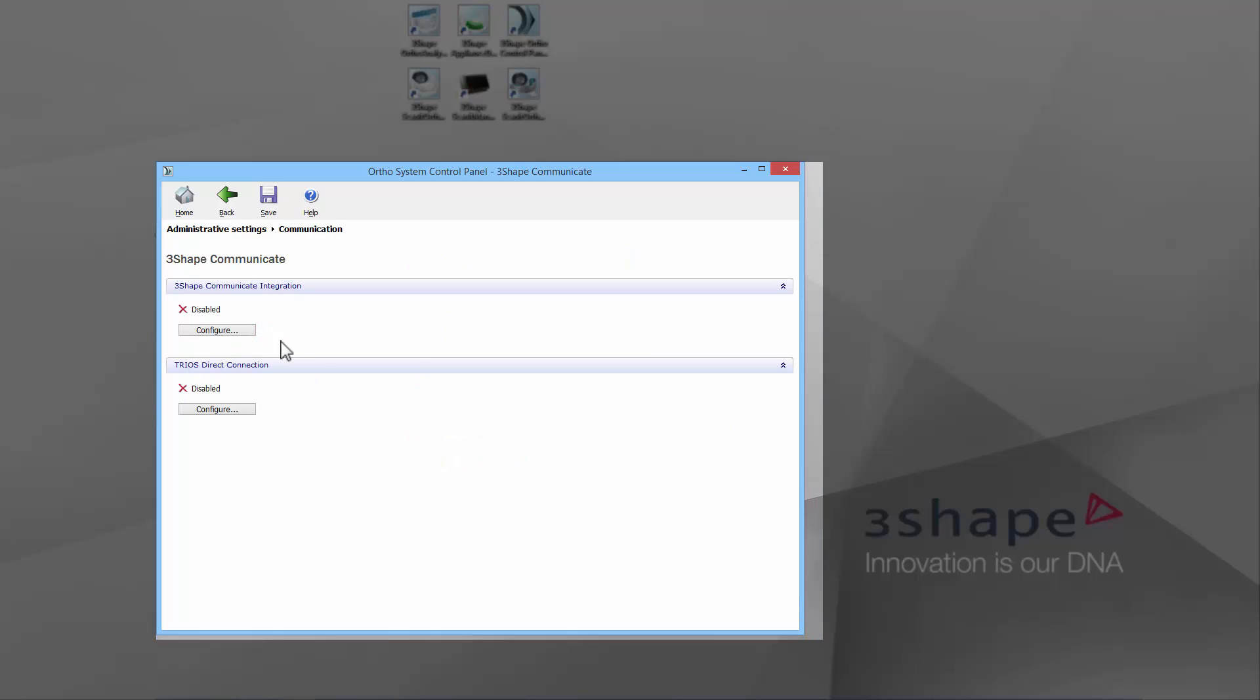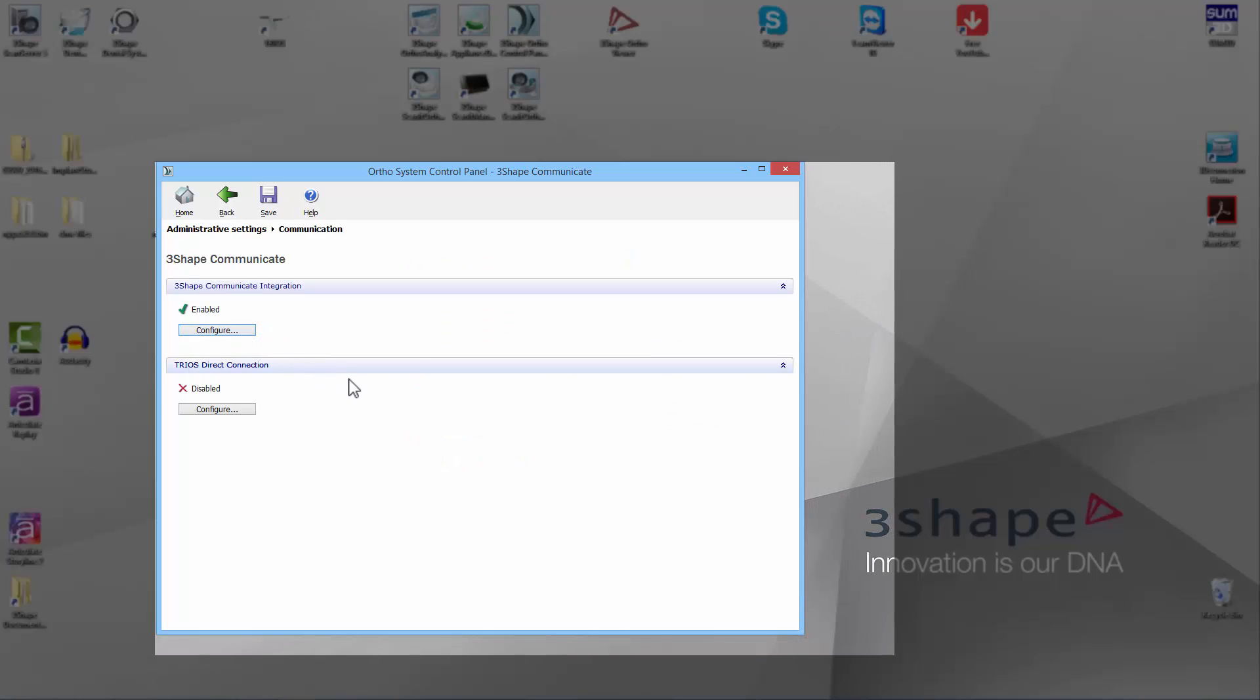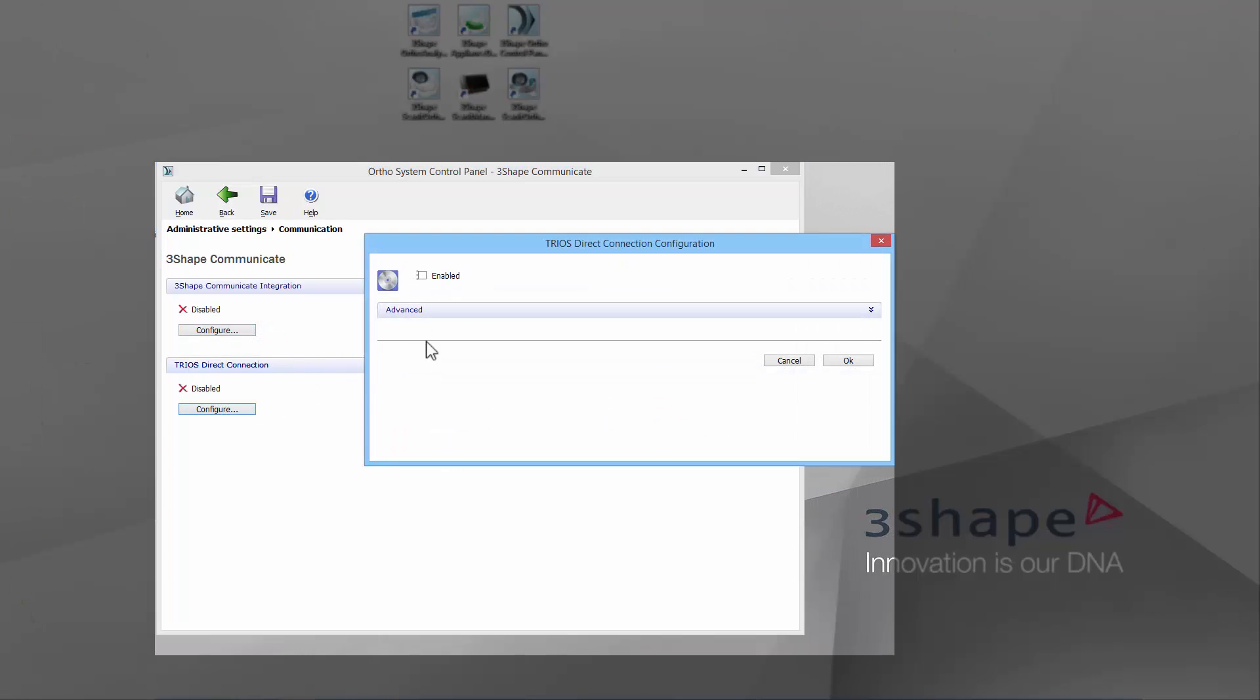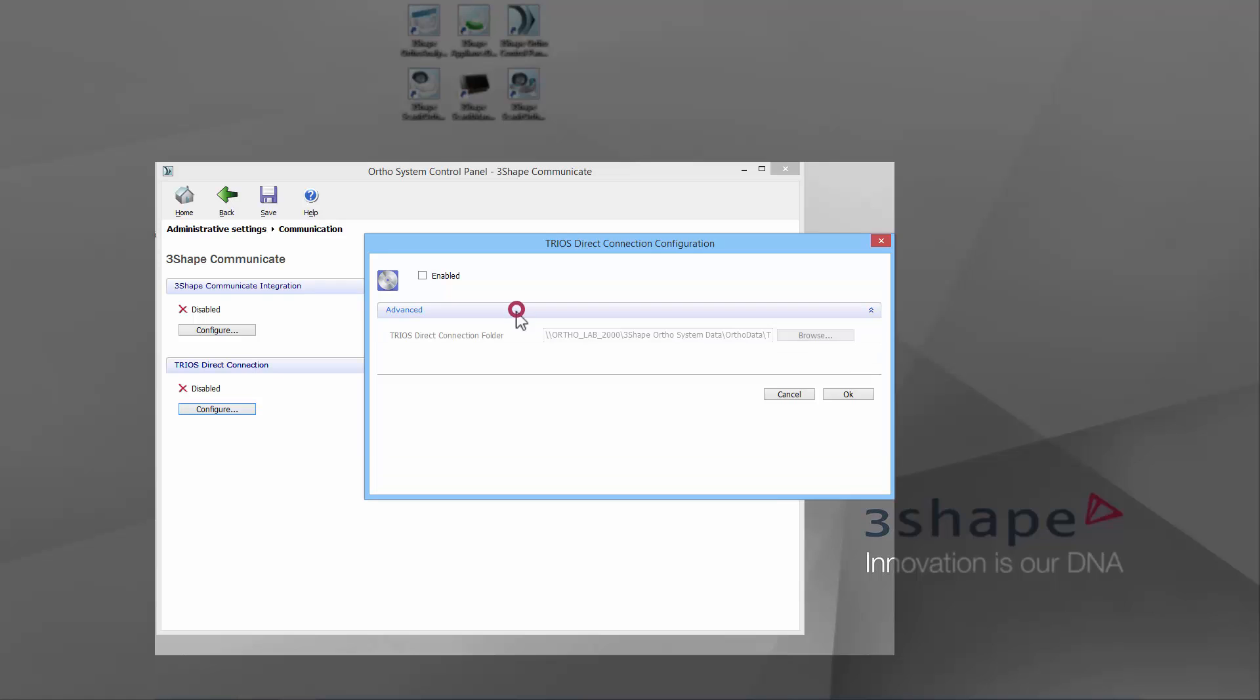To configure the TRIOS Direct Connection, click the Configure button in the corresponding tab. You must check the Enabled option.